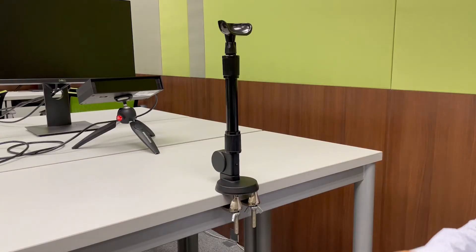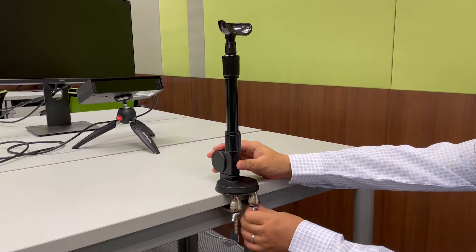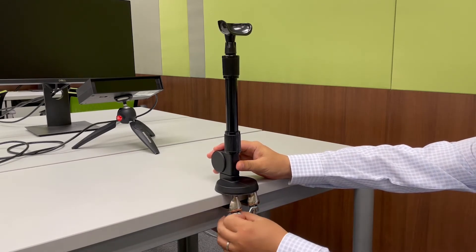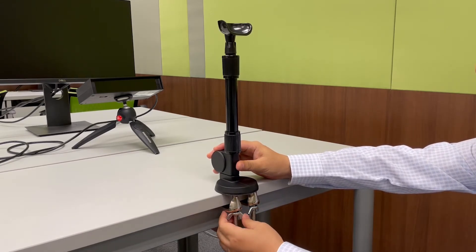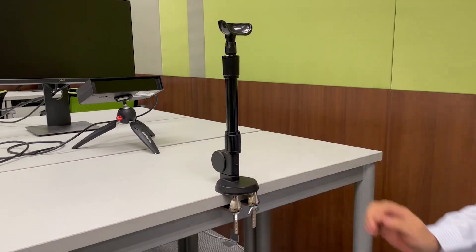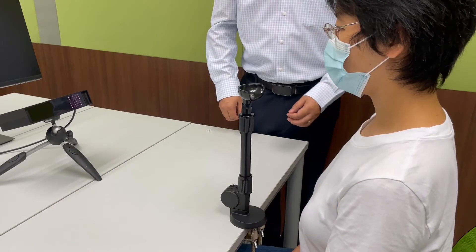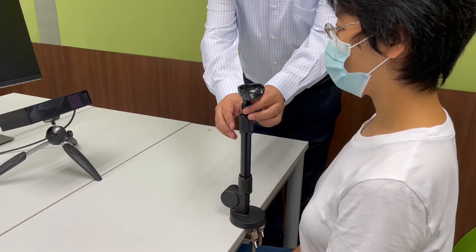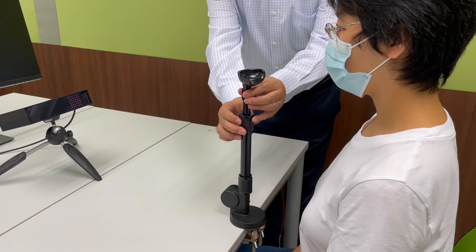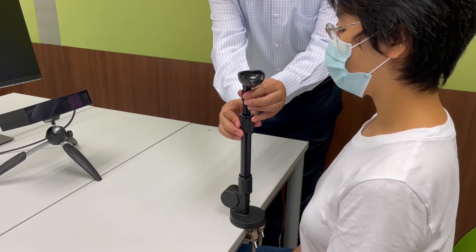To use the chin cup, we tighten the wingnuts so that it clamps to the edge of the table. Adjust the chin cup to a proper height.